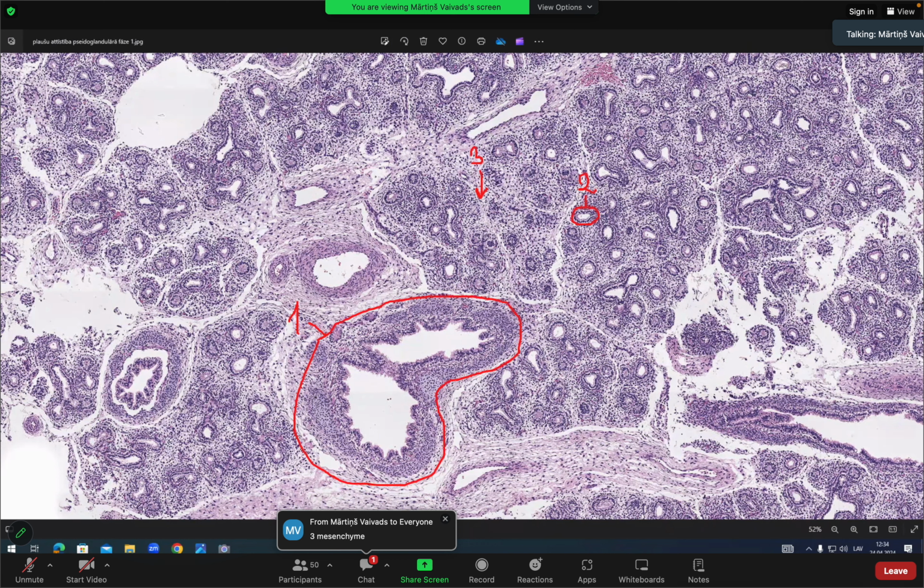I don't know why in the structure list it's written there's glands. No glands are developing here. You won't see glands here yet. They will appear in much later stages. So no glands yet. But bronchioles are developing and bronchi are developing. That's the main idea. What else?